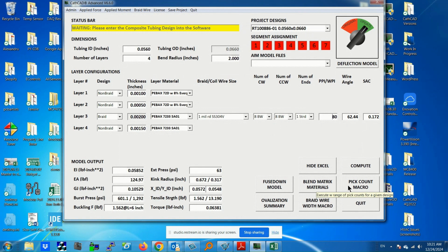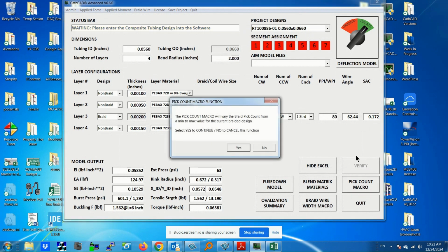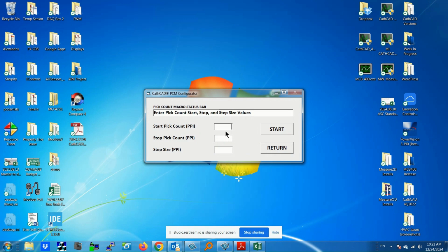So I have a defined design, and I want to look at a wide variation of pick count for this design. I select this pick count macro, and it says, hey, I'm going to do this for you. Do you want to go ahead? And I'm going to say yes. And now I'm going to enter a min and max value and a step size. So we're going to go from 20 up to 150, increasing the density as we go along the shaft. And then the question is step size. So we're going to go every 10. So basically we go from 20 to 150, step size of 10.